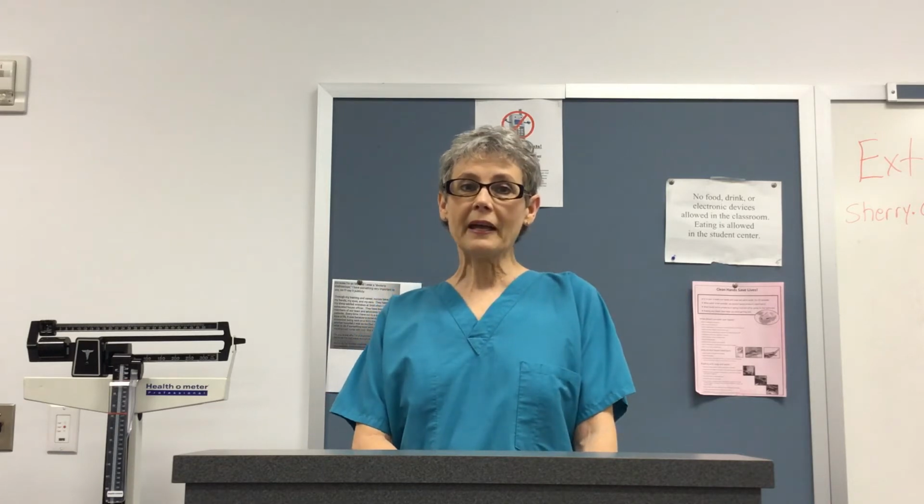To have IV therapy, you have to have an IV catheter. Now, this is normally started by the nurse. If you have to have a central catheter, this will be inserted by a medical doctor. IV fluids can either be intermittent or continuous. So let me explain that.